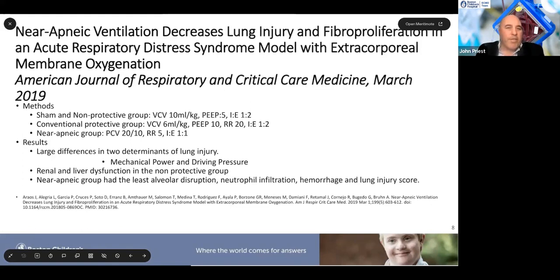So just getting into terminology as we go through this presentation, I'm a respiratory therapist, so this comes natural to me, but if you're not, a pressure control of 20 over a PEEP of 10 is what we call a delta P of 10. So it's 10 plus a PEEP of 10, which gives you that pressure control of 20.